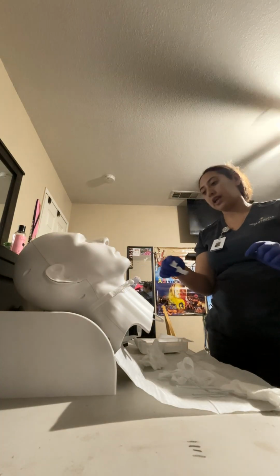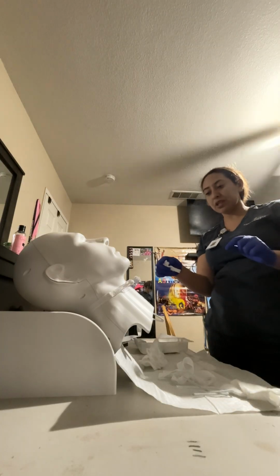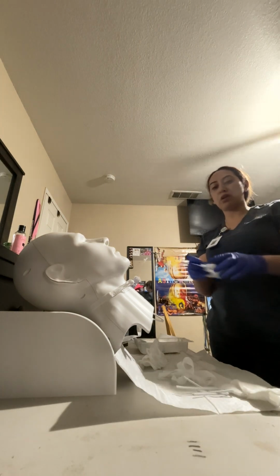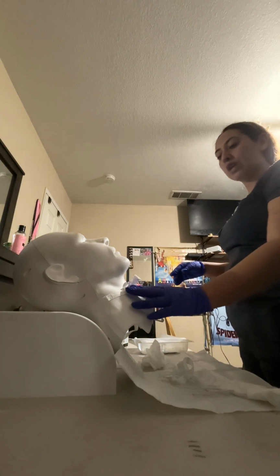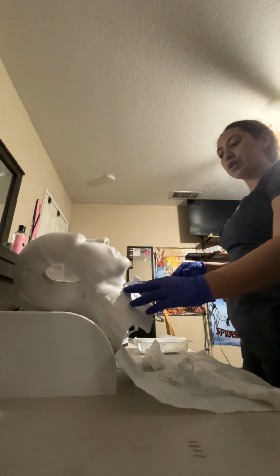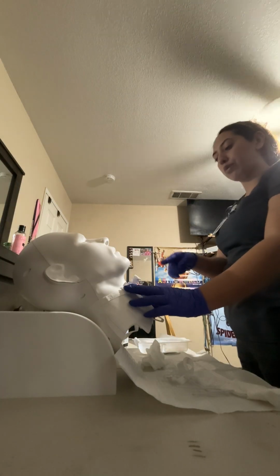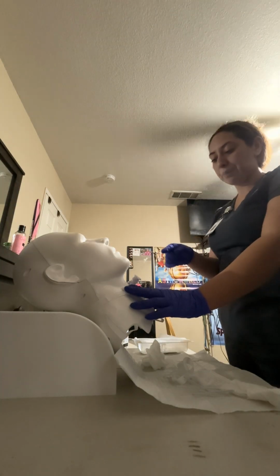So for this portion, I will need a second set of hands. So I'm going to have my coworker come in, clean their hands, and apply PPE. They are going to hold down the side of your trach ties while I remove one side at a time.